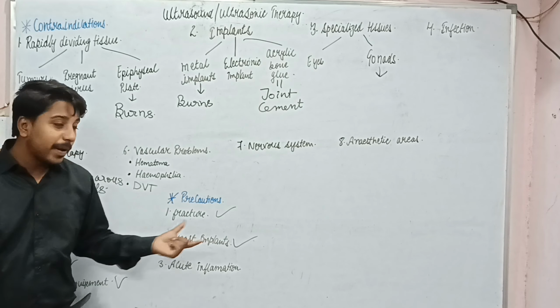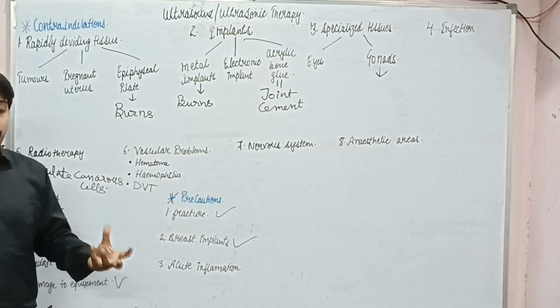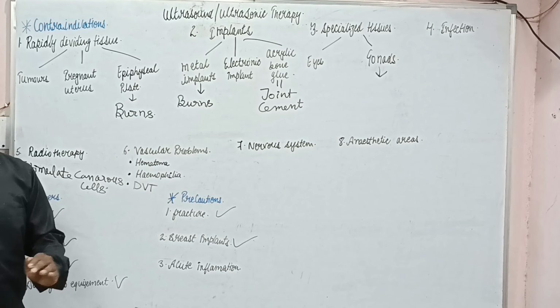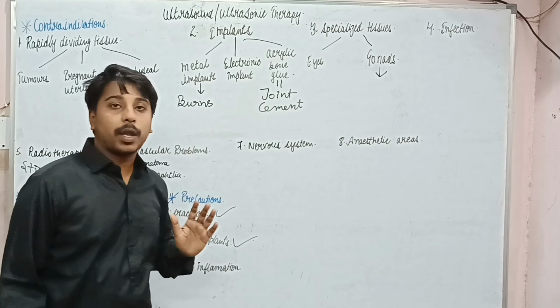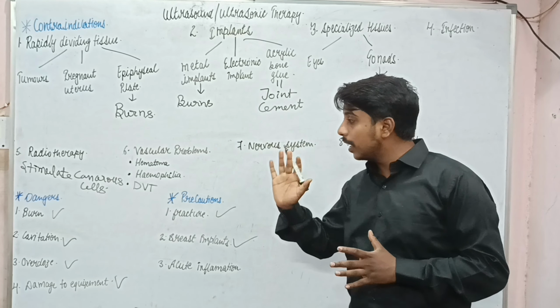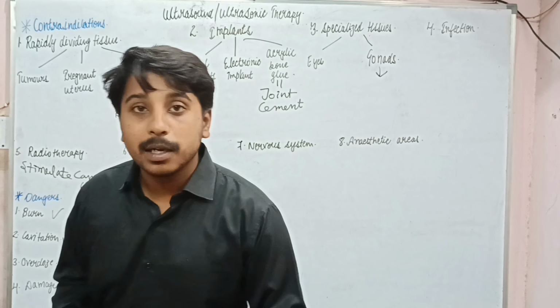Okay, so in case of breast implant also, it can cause the loosening of the implant. So here also we need to give the less intensity of ultrasound. Okay, so this was about the lecture, which is contraindication, danger and precaution. Now let us just summarize it quickly.